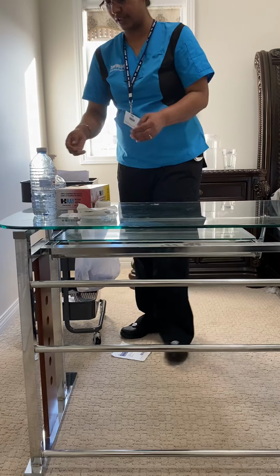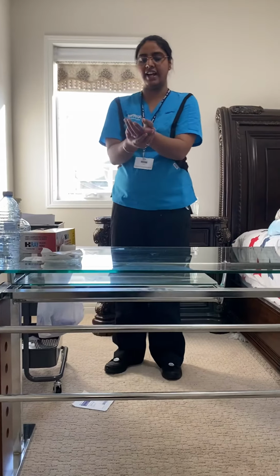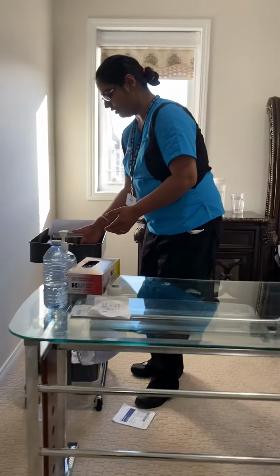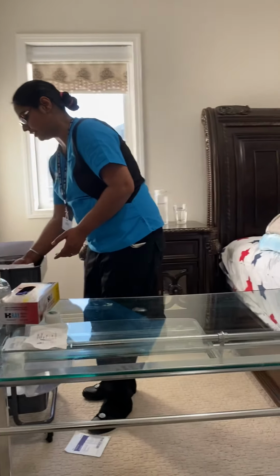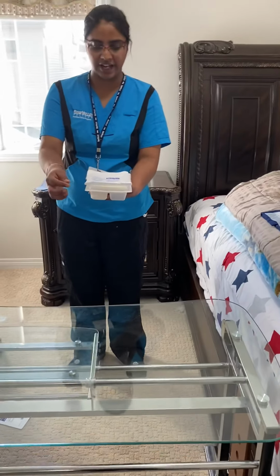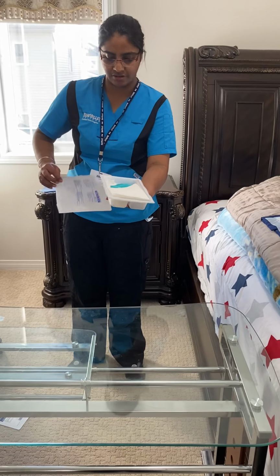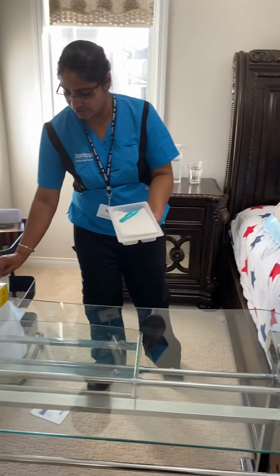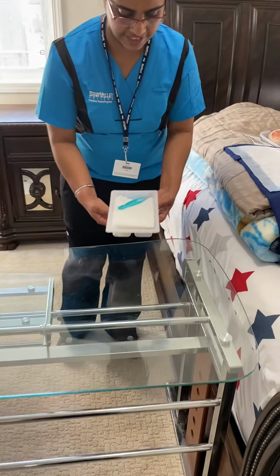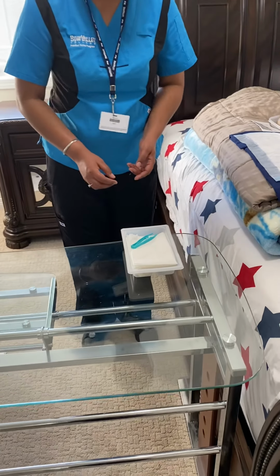And now again I'm starting to maintain the sterile field. So again, hand hygiene for 30 seconds until dry. Now I grab my tray from the inner side, avoiding the edges as you see. So now I'm peeling this wrap towards me in order to avoid cross contamination, and put it in the garbage. And so I let it place on the table, and there is a green forceps.